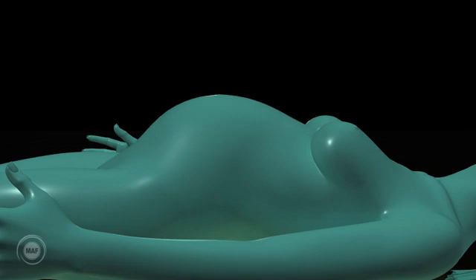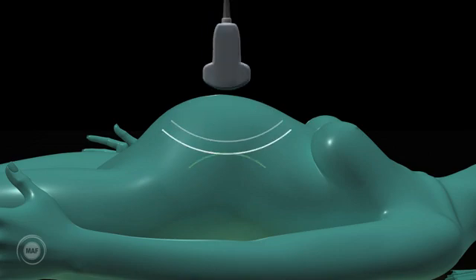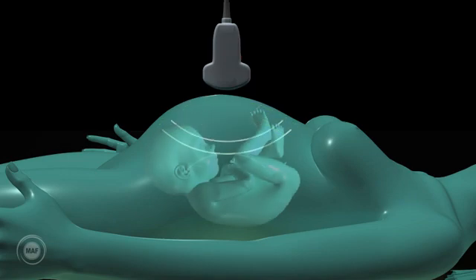The sound wave then travels through different tissues in the body which have a different penetrability, also known as acoustic impedance. So part of the sound energy is reflected by the tissues and part continues to travel through until it hits other tissues and is reflected back.